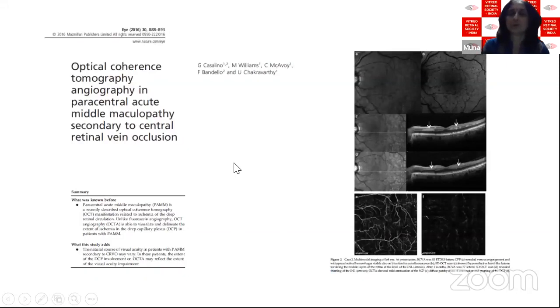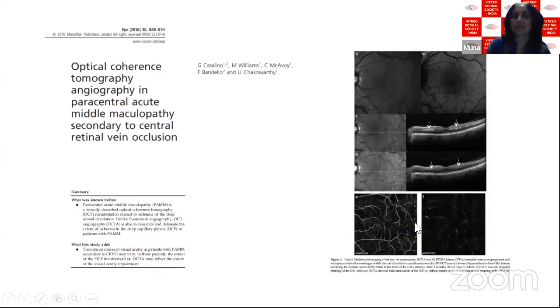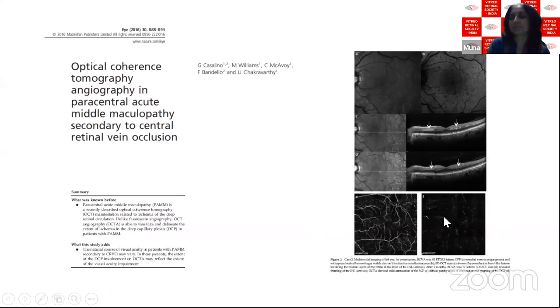An important finding in patients with retinal vein occlusion and unexplained visual loss — not attributable to atrophy or edema — is ischemia in the deep capillary plexus: paracentral acute middle maculopathy (PAMM). On OCTA, the superficial plexus looks normal but a dark area with a ferning pattern in the deep capillary plexus is very typical of PAMM, which should be suspected in any RVO eye with unexplained vision loss.